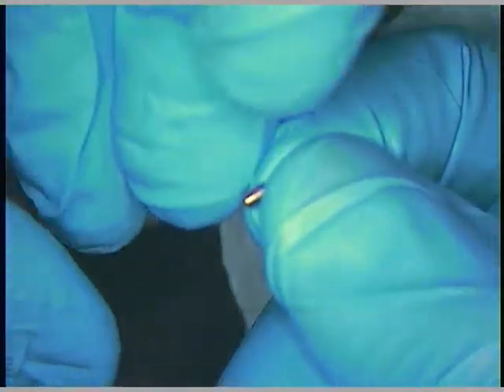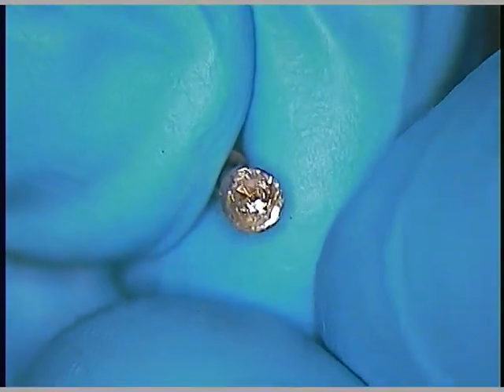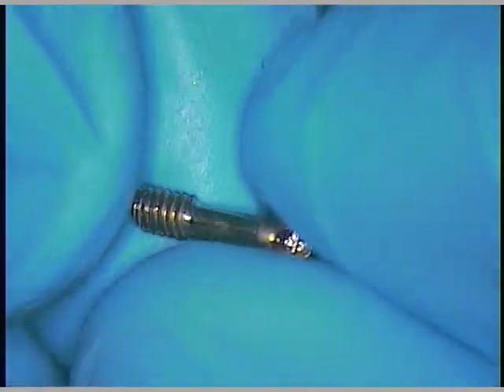All right, I'm going to summarize real quick. So here's our screw — you looked at the head of the screw as we were turning it out. There it is. It's a gold screw. We're going to analyze this one later — definitely analyze it, because that's going to help.